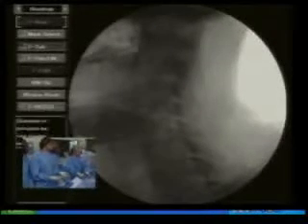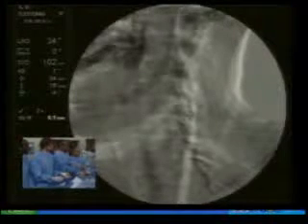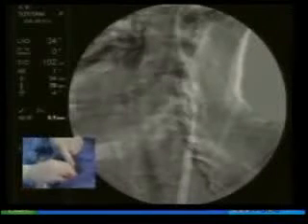Okay. And we wanted to position this where we'd be able to inflate the balloon in the common and actually see that, and then see the area where we'll be working in the common and the internal carotid. So we've done some road mapping. What Steve's doing now is getting ready to... I've placed the external carotid balloon in the EC port right here.